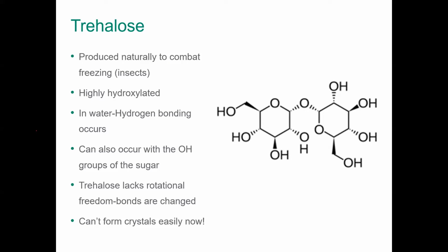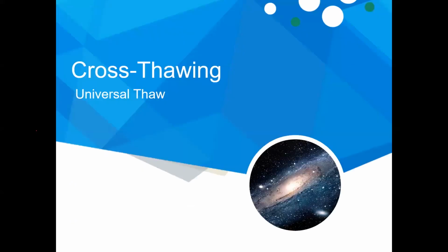So this is, again, all the components that we need to vitrify with any media, and it's the same for all laboratories when they try to make the vitrification media in-house; they use the same principles. But we have more commercial media now, and vitrification is theoretically all based on the same principles. So most of the media use the same principles and the same ideas to make the media. But not all the laboratories use the same media.